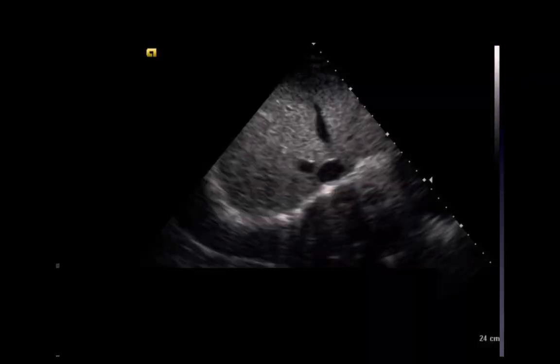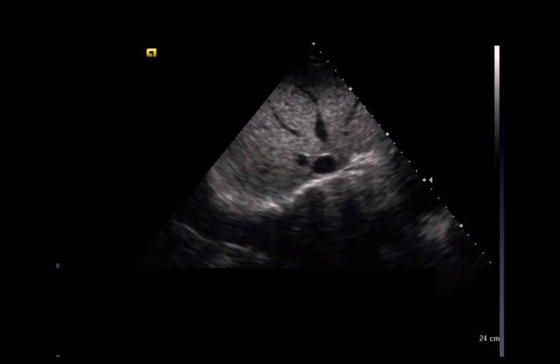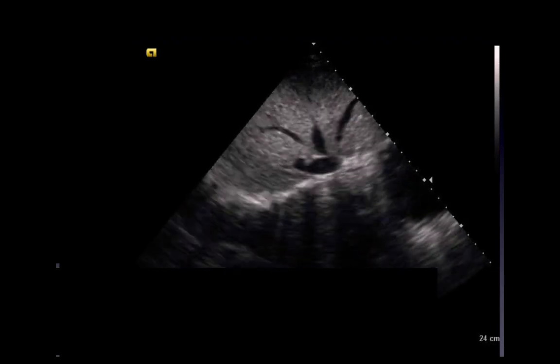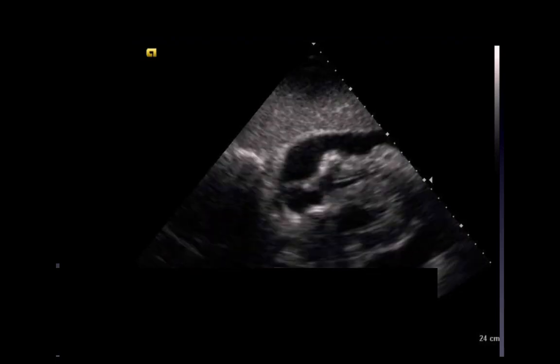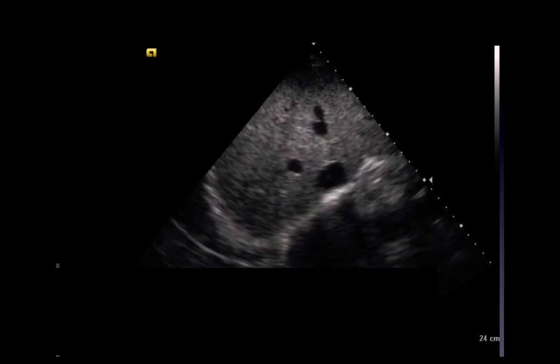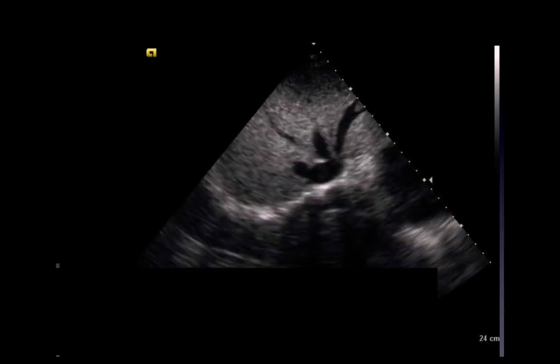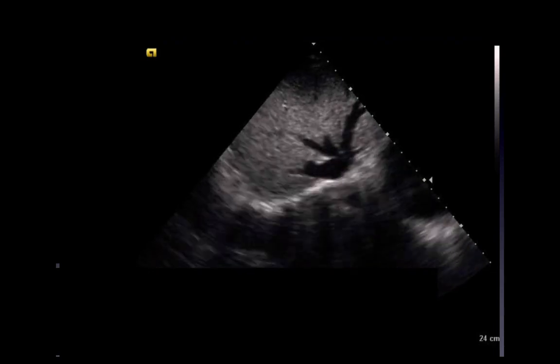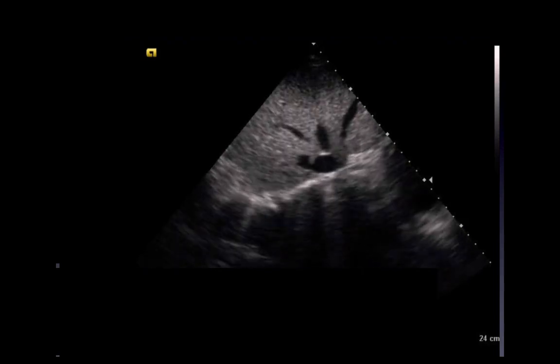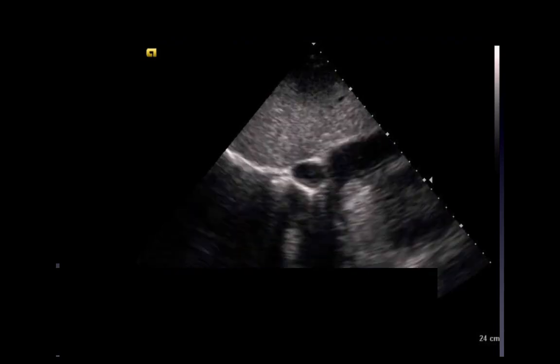Okay, what do you think about the patient's volume status here? Let's take a look, let me know what you think. Transverse view of the IVC. You can see the hepatic veins coursing toward it. Okay, so at the very end, did you guys catch that? That was a patient who had a large circumferential pericardial effusion with evidence of tamponade physiology. So this is exactly why it's critical that we include a point-of-care echo with each IVC study that we do, because the pump is going to play a major role in the IVC metrics.